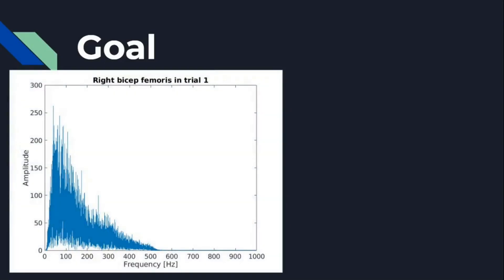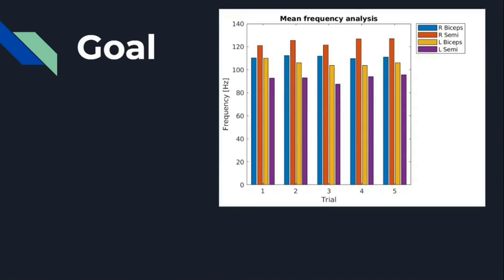The goal of this video is to make this FFT plot — x-axis is frequency and y-axis is amplitude. Like I showed in my previous video, I did amplitude analysis where x-axis was time, but this time x-axis is frequency in hertz. After that I'll show you how to do mean frequency analysis based on this FFT plot.